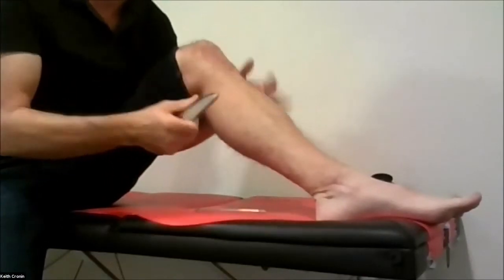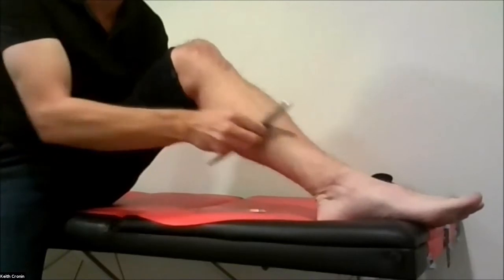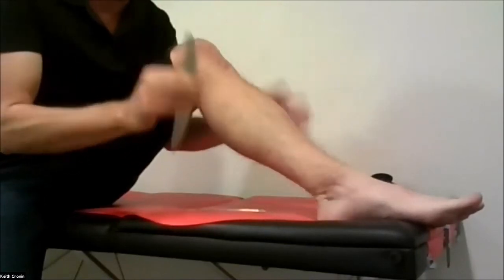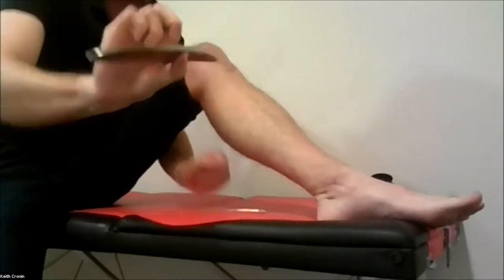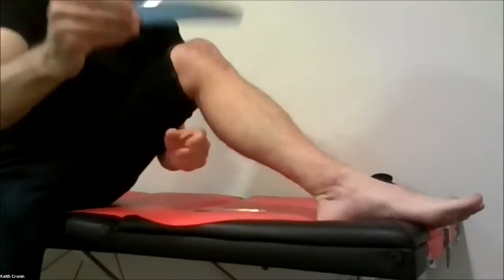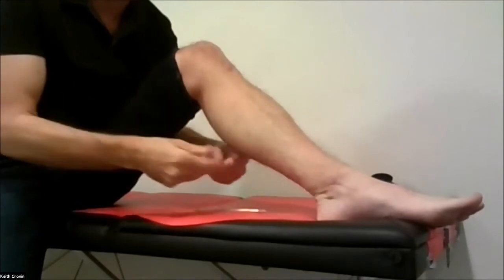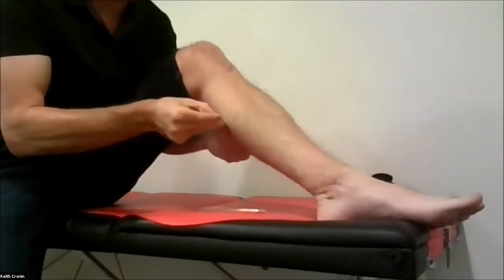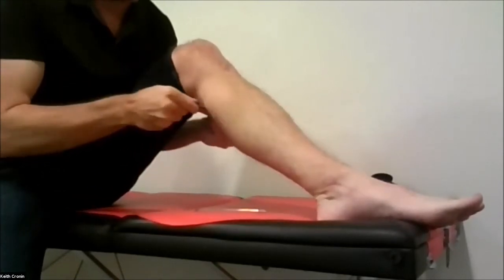And then normally I would put on an emollient, which would be something that would go between the skin, but just for time-intensive purposes, I'm not going to do that today. So we have our beveled edge right here, and I always want that facing down through the skin. So if I were to flip this the other way and I go like that, I'm not grabbing the edge. I have to make sure that the edge is always working down.